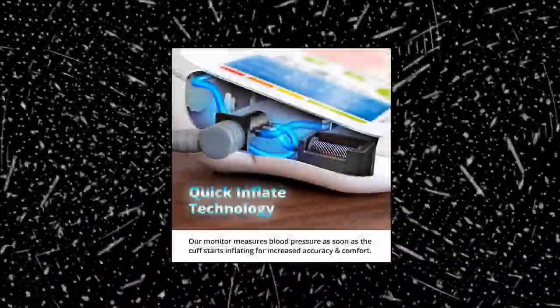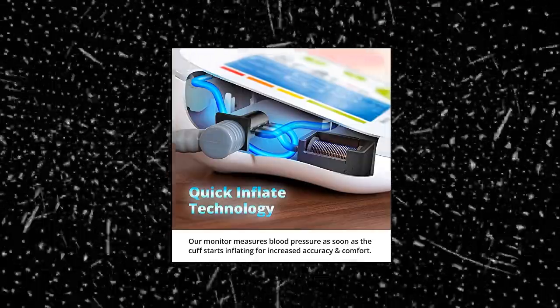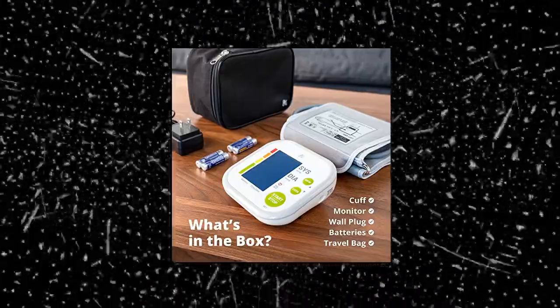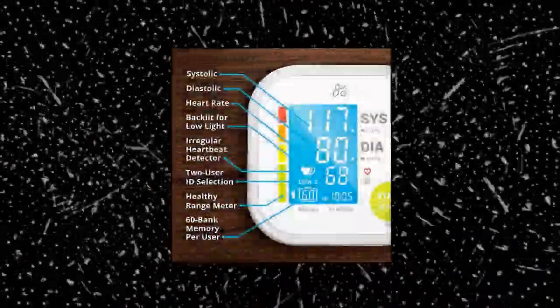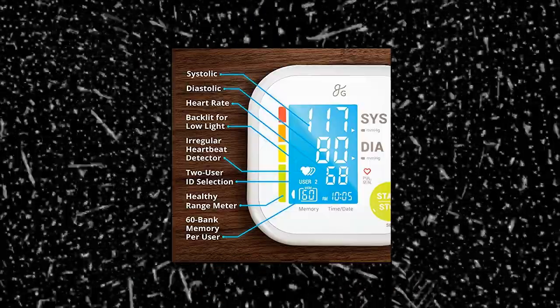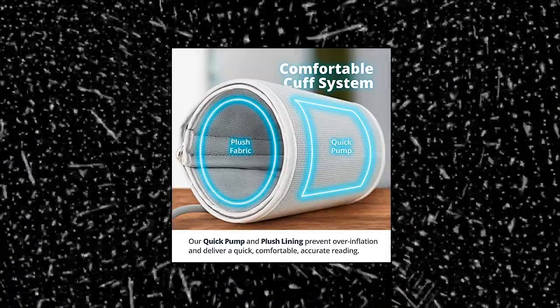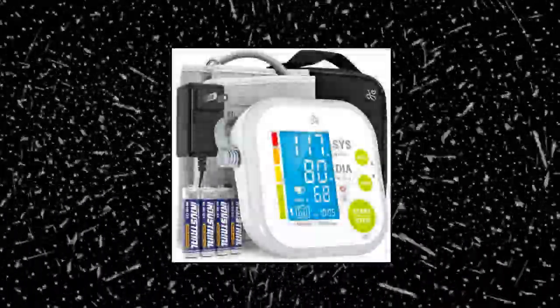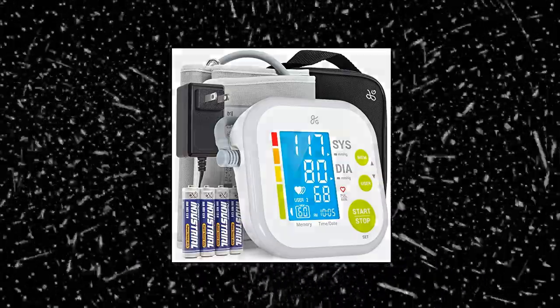Greater Goods Blood Pressure Monitor — available as a complete kit, standard kit, or complete kit with wall adapter. The Greater Goods Blood Pressure Monitor kit comes with everything you need to make tracking heart health over time as simple as possible. Keep up with your systolic and diastolic blood pressure as well as your pulse. Compatible with two users, storing up to 60 measurements for each. Features a bright backlit display, large stop/start button, and an irregular heart rate detector. The Greater Goods Monitor is the definition of what a BPM should be.